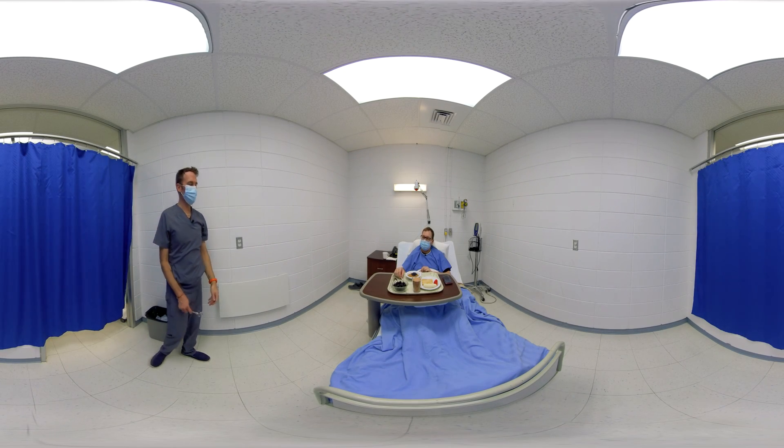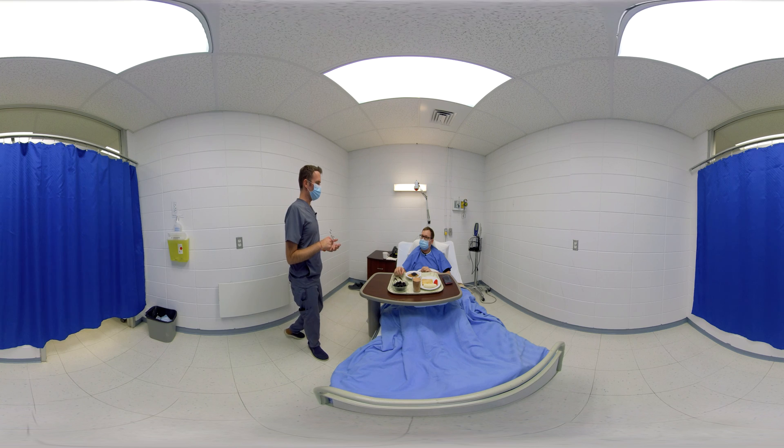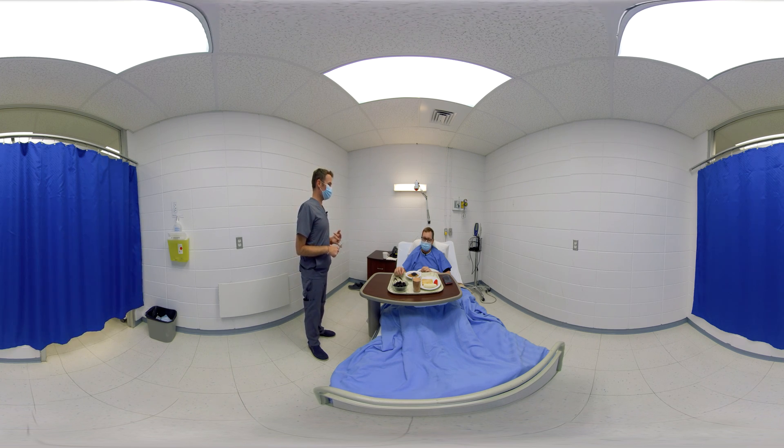Hello, Mr. Turcotte. I have good news for you. My name is Phil, and your doctor has asked me to remove your urinary catheter. However, he has also asked for a urine culture before we can do this. I'm going to clamp your catheter for about 20 or 30 minutes before I take the urine sample. I'll be back soon.